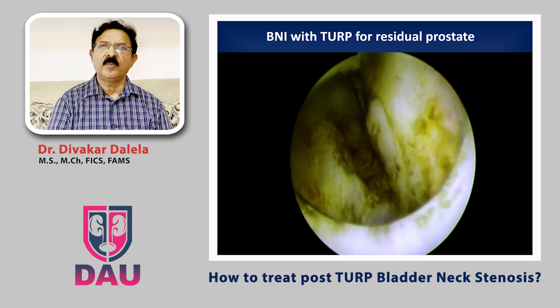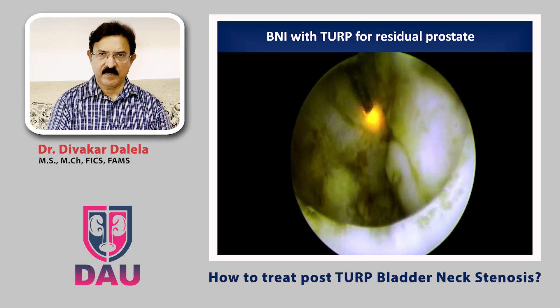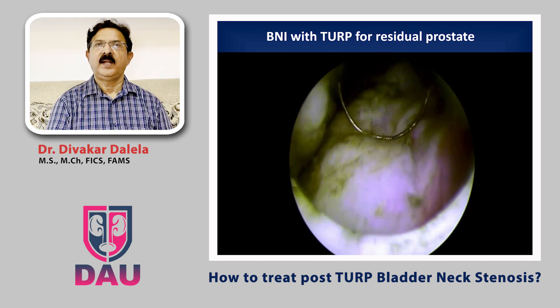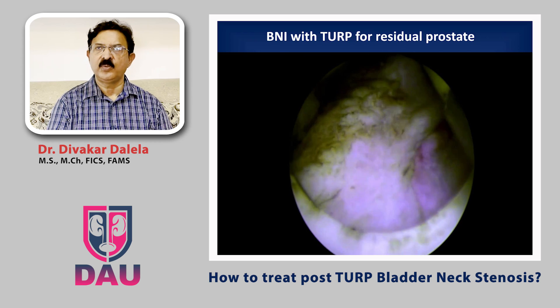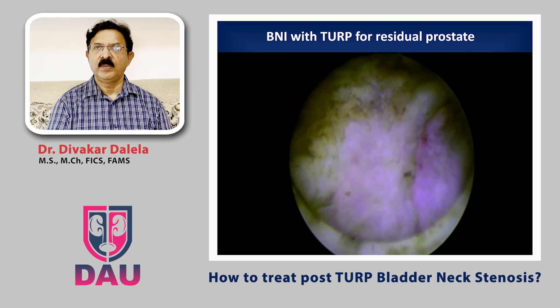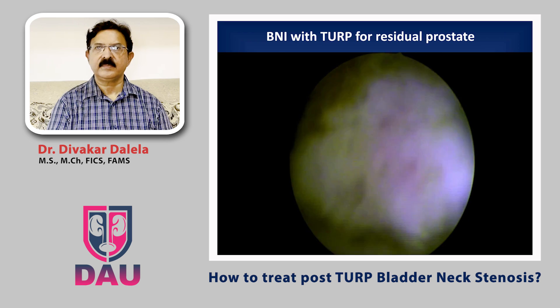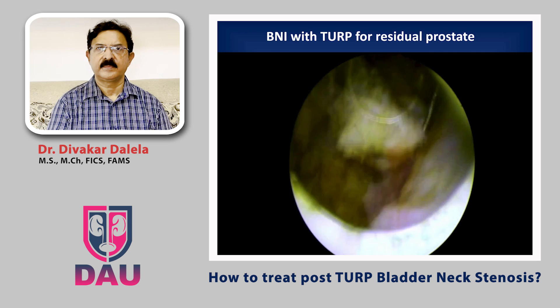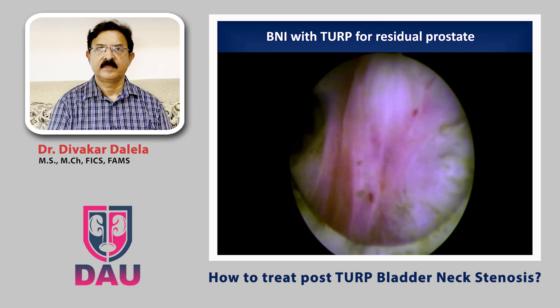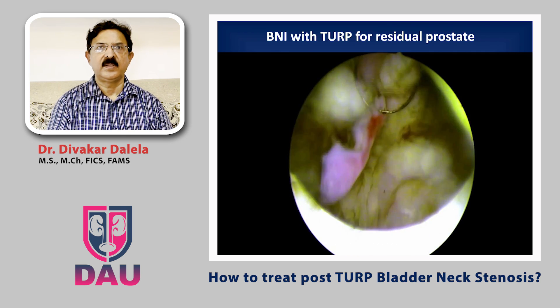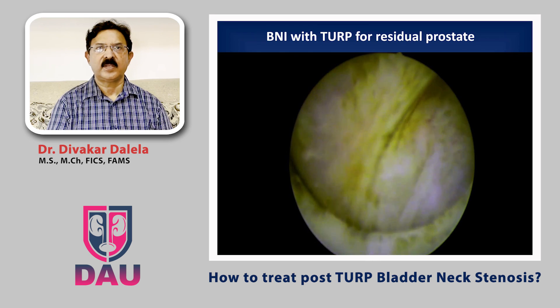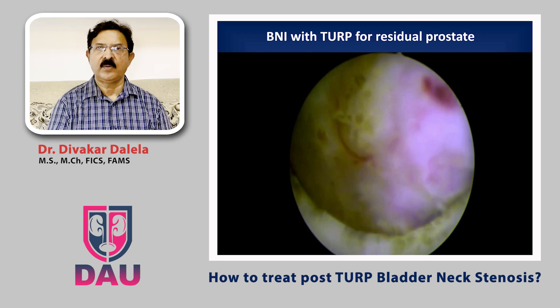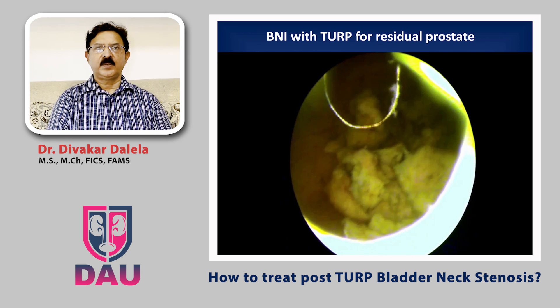These are the operator's subjective assessments. Now you take a regular resectoscope loop and it is better to resect whatever residual prostate tissue you are seeing below the bladder neck — and that was what was done in this patient. Gradually you resect the prostate below the bladder neck and give the patient a wide open bladder outlet. This is the resected tissue inside the bladder.